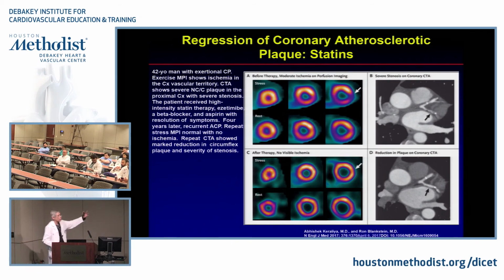But this is a growing area, and I think it's a very important one because people are wondering what is the reason? How is it that statins improve outcome? I think there are probably multiple reasons, but you can clearly see improvement in perfusion abnormalities on statins. That's been shown in many, many articles using SPECT imaging as well as PET imaging. And now with CT, we see maybe the basis behind that, whether this is improvement in vasomotor tone or lack of vasoreactivity as well as reduction in low attenuation plaque.